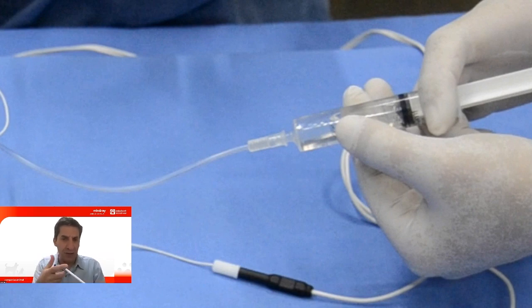And during injection, if the needle is attached directly to the syringe, you can move the syringe, the tip of the needle, and touch the nerve. So the extension line is mandatory.